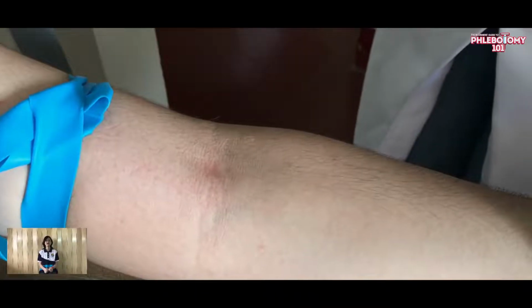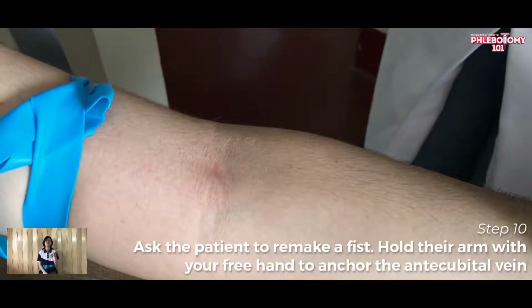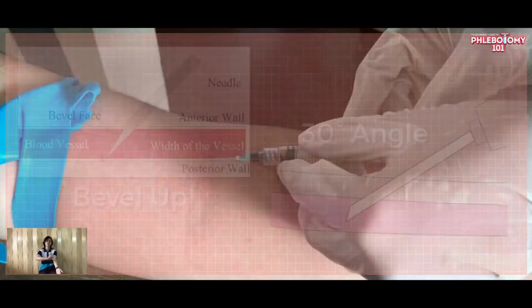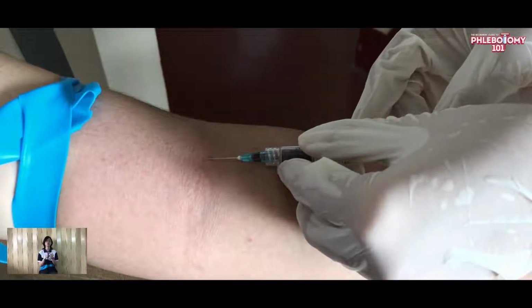Step 10. Ask the patient to remake a fist and hold their arm with your free hand to anchor the antecubital vein. Then, insert the needle with the bevel facing up using a smooth forward motion in a 30-degree angle. Then, fill the syringe with the required volume.